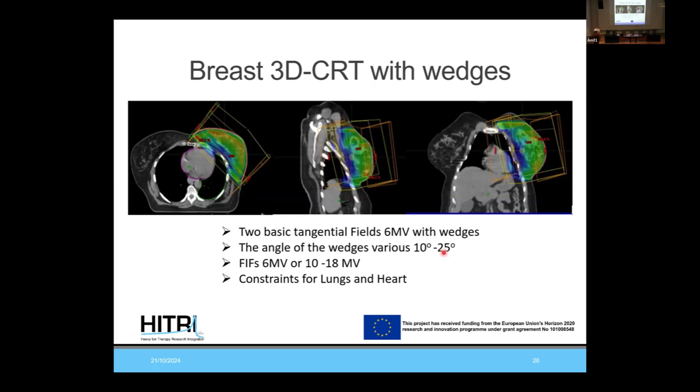It's basically always the lung that is the problem. We are going to put the beams in that way. We are going to rotate the gantry in that way so we can protect the other breast. It's the basic principle here. We do not want to irradiate another region for no reason.